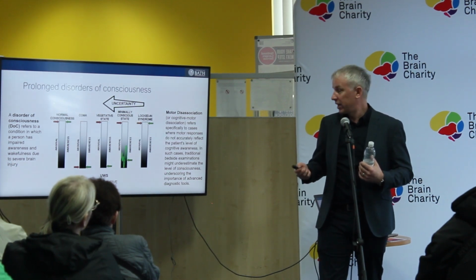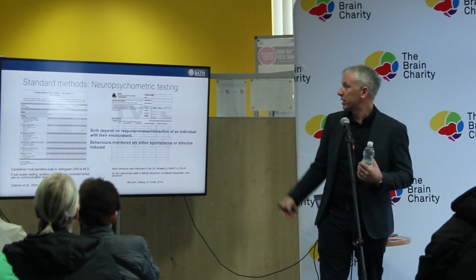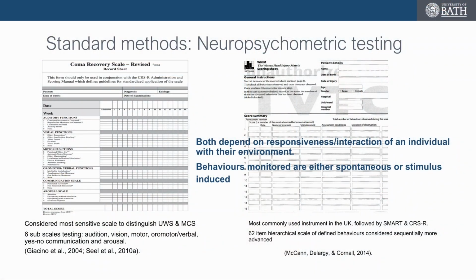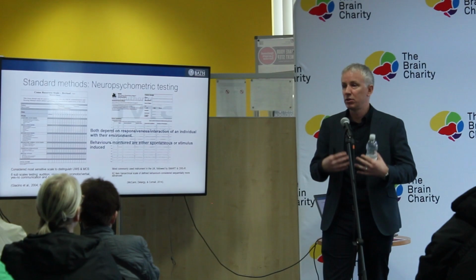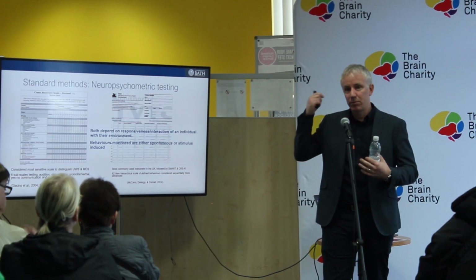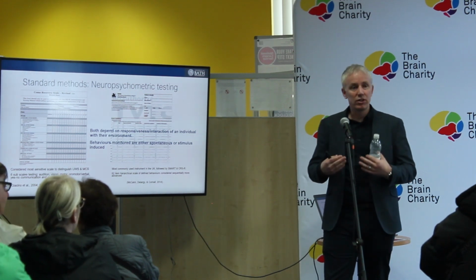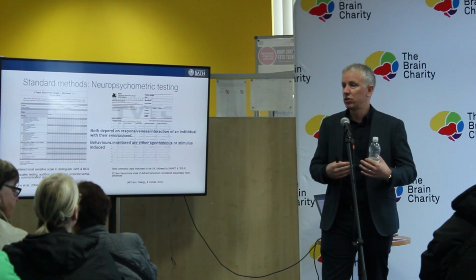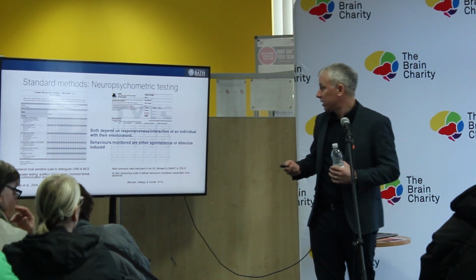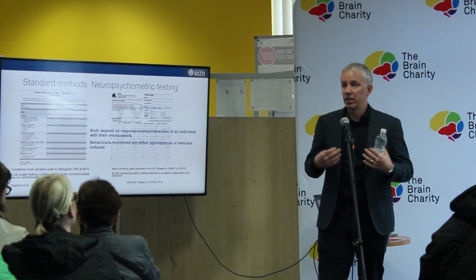And sometimes we misdiagnose people because they're not able to overtly respond. And we use standard methods like the Coma Recovery Scale Revised or the Wessex Head Injury Matrix. And these are very subjective scales where a speech and language therapist or the multidisciplinary team will ask the person to move their head or shake maracas around their head or ask them to do a body blink or a hand movement. And sometimes if that's not consistent, then they would assume the person's not able to respond and can lead to misdiagnosis, whereas a brain-computer interface is completely movement independent.